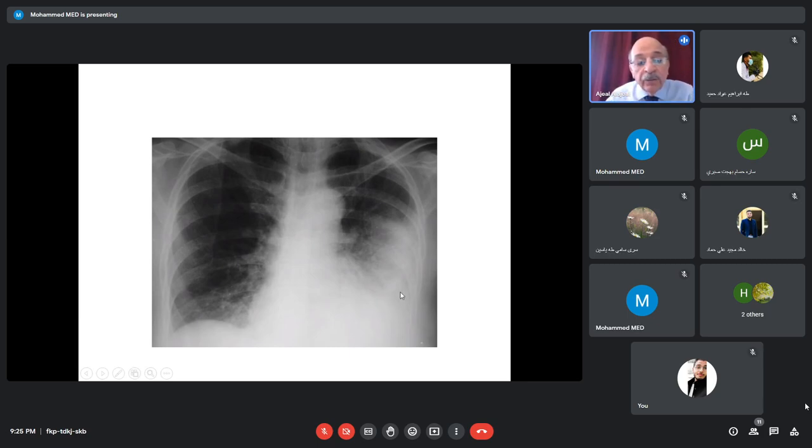And as a matter of fact, if you go up and see the trachea, it is a little bit shifted to the right, which indicates that there is a sizable pleural effusion. The trachea is higher up. Okay? So we have finished now the examination, palpation of the chest.